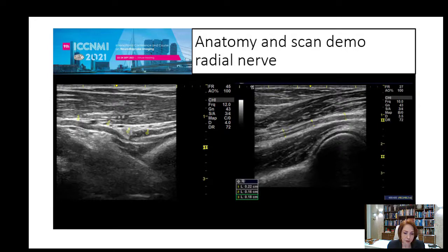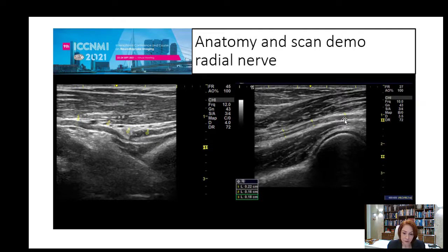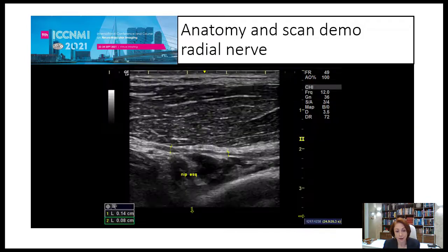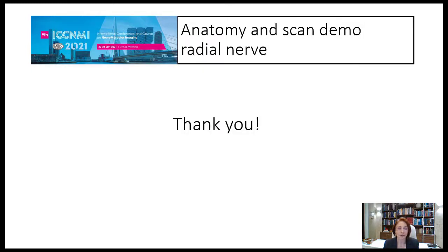Be careful when you see enlargement of the posterior interosseous nerve without signs of compression. On the left, you can clearly see the compression site and the enlargement proximal and distal to the lesion. On the right, the posterior interosseous nerve is homogeneously enlarged without signs of compression — this could be secondary to Wallerian degeneration caused by a proximal lesion. Follow the nerve in its entire length and perform both transverse and longitudinal images. Remember that humeral fractures can also cause distal stretching with lesion of the posterior interosseous nerve. I wish you all a great time and enjoy this beautiful meeting. Thank you.